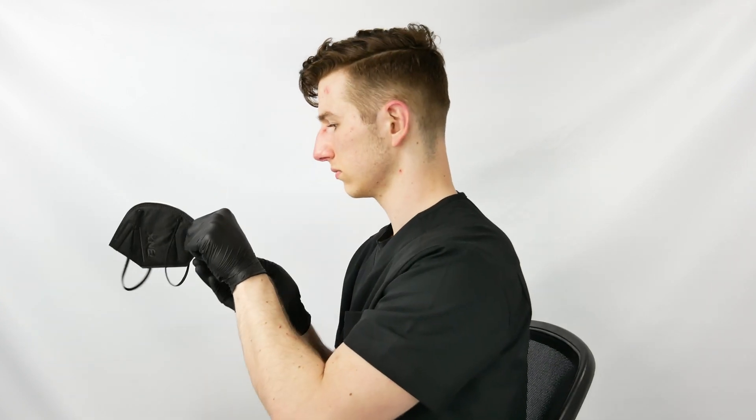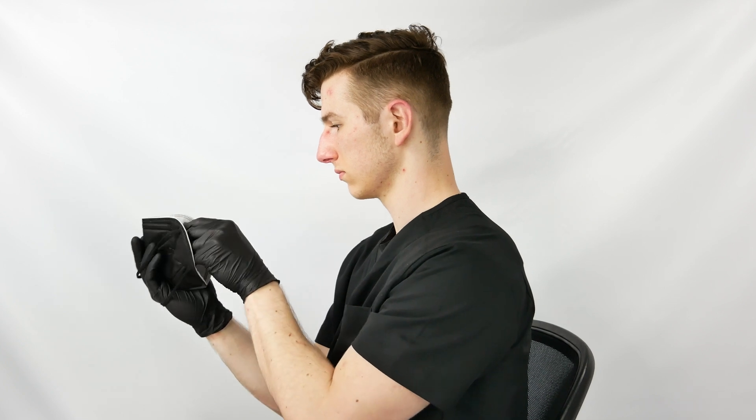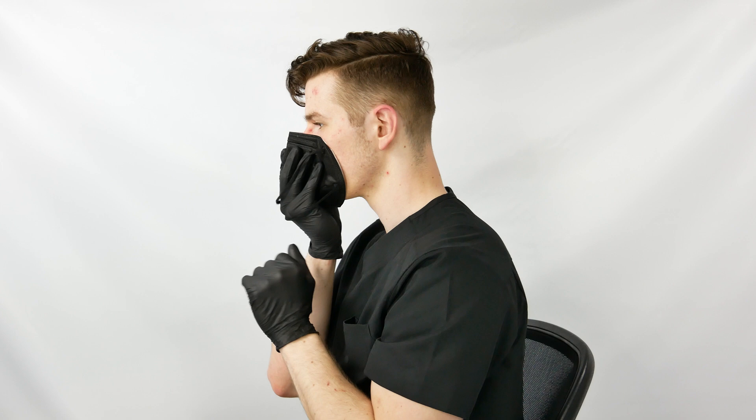Insert your hand through the headbands and cup the mask with the palm of your hand. Open up the mask slightly. Place the mask on your face, covering your chin and nose.